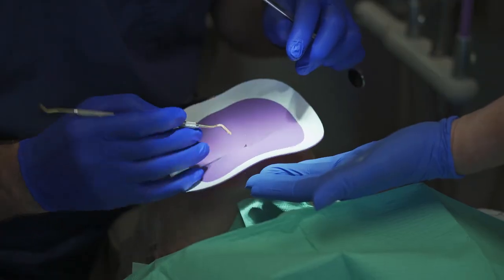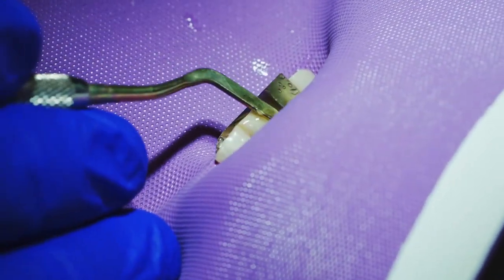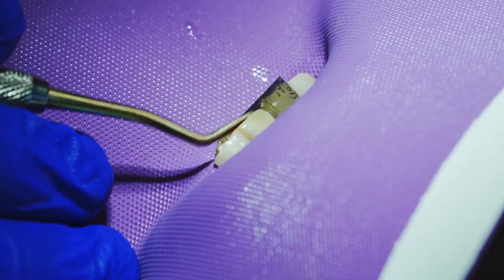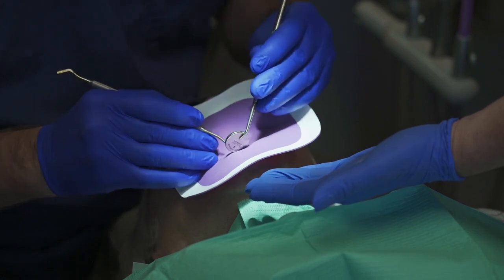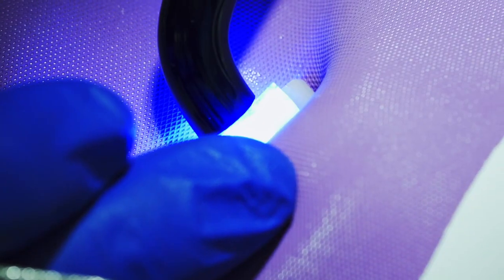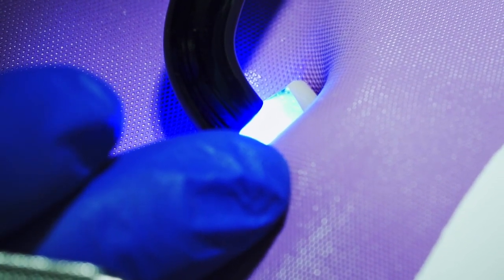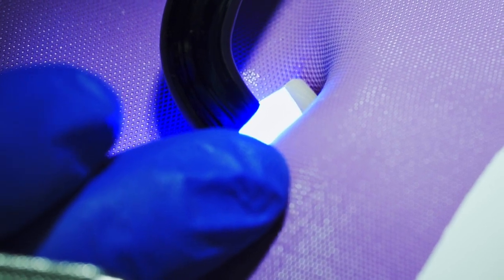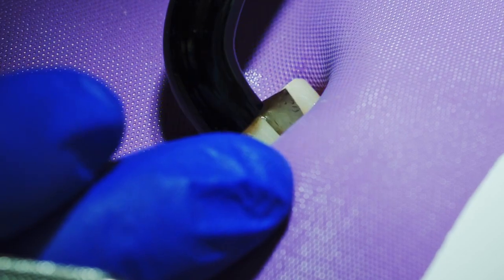This product has a 10-year track record in my office, and I have them in about 160 different patients over the years. This is also an amazing product for wear facets, especially in the molars where you have the dished-out enamel and it's just dentinal exposed tissue. You insert this right in the center of it, then build around it, and they just don't fall out.